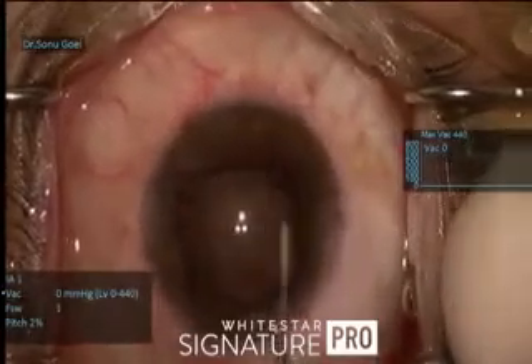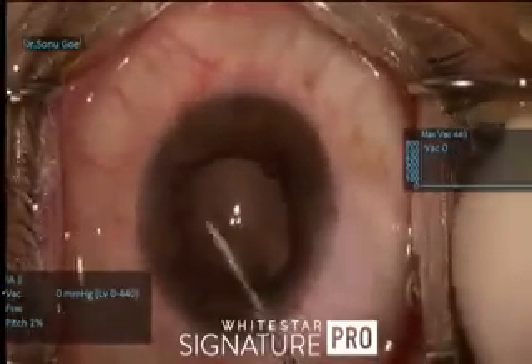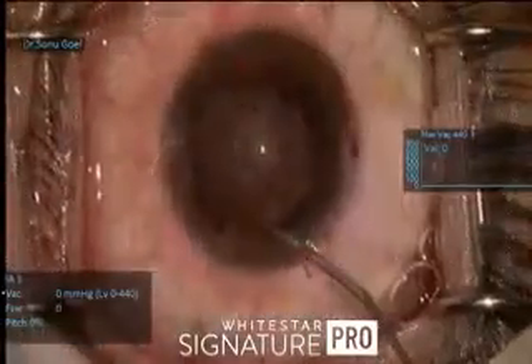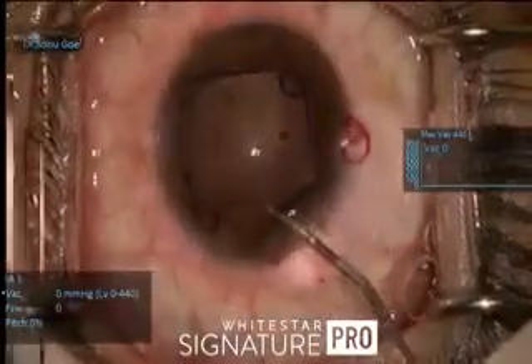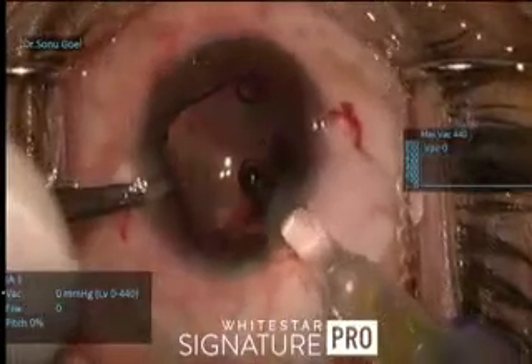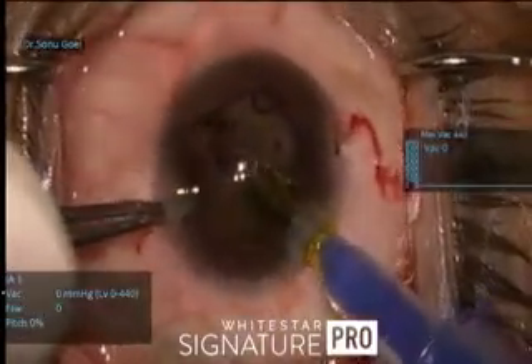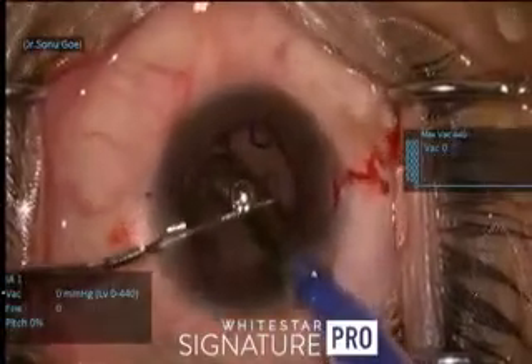Very carefully, the center I tend not to touch. This is how the rhexis is well centered, and a pre-loaded aspheric hydrophobic yellow IOL comes and sits in the bag.